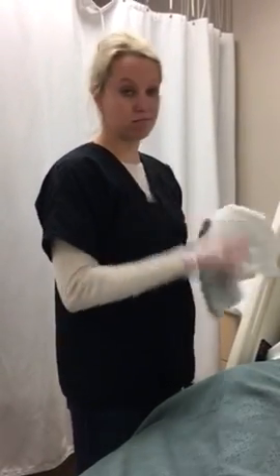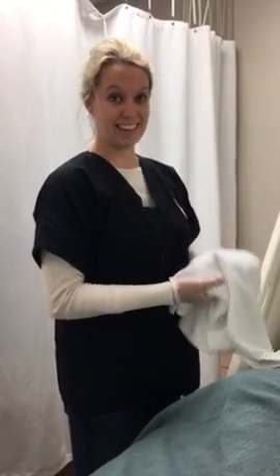And we're also going to test for patency. So I'm going to ask the patient to occlude one nostril and breathe out, occlude another nostril and breathe out. And then come back and check on the patient just to make sure everything's going well. Thank you.